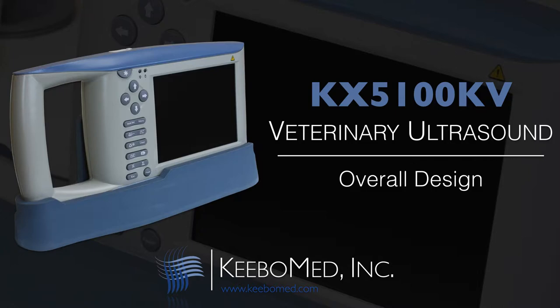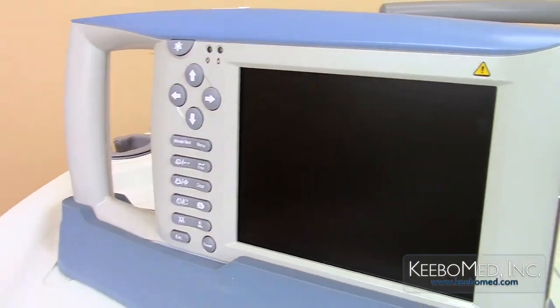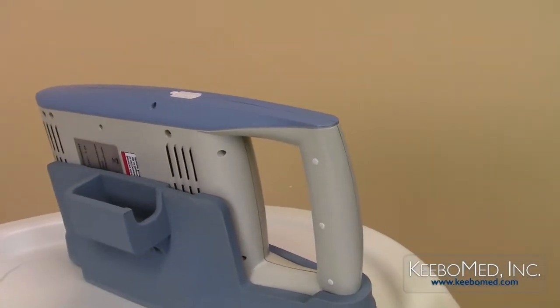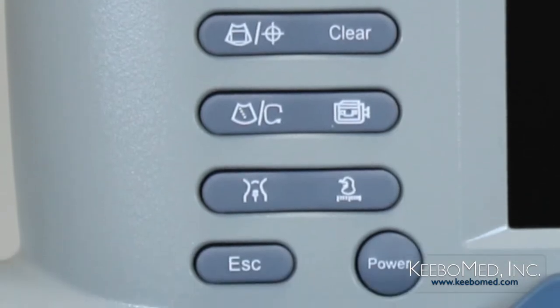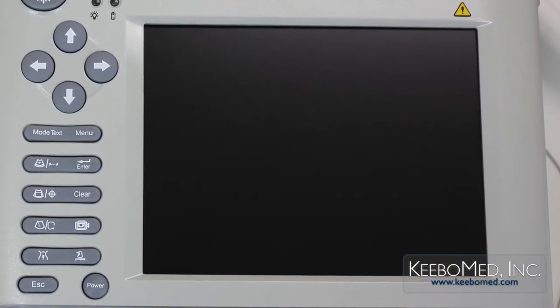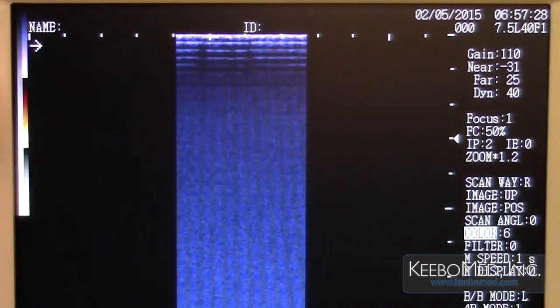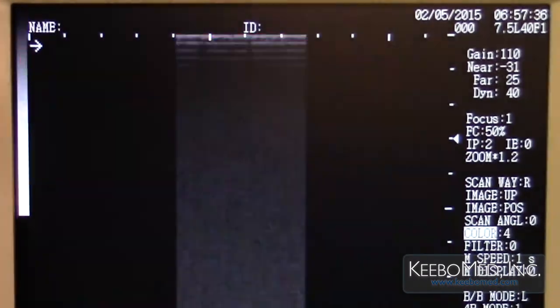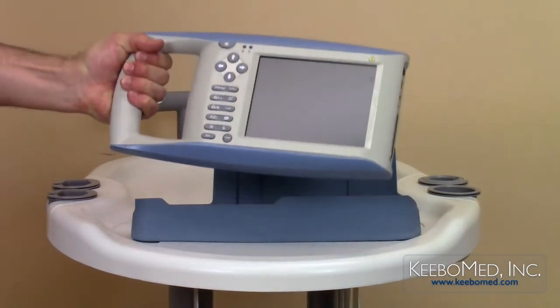The overall design of the 5100KV highlights the purpose of this system in being a highly portable handheld ultrasound that is easy to use. The simple design includes a small set of functional keys to easily operate the system. It features a large LCD screen size of 6.4 inches that produces good image quality, with color capabilities producing 8 pseudo colors including black and white. It has a strong integrated carrying handle and is very lightweight.